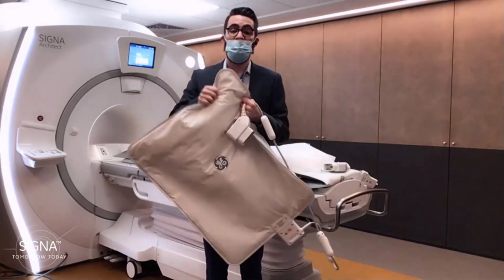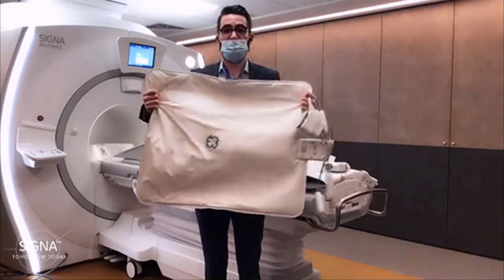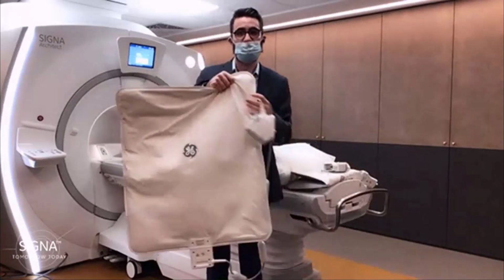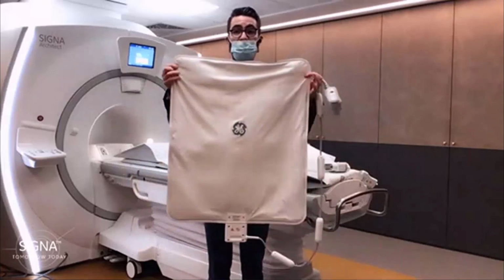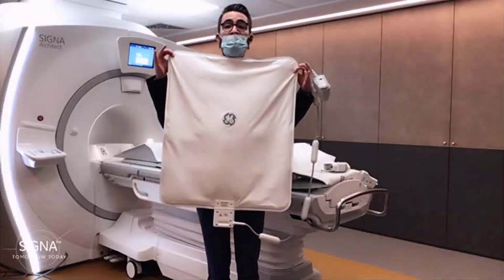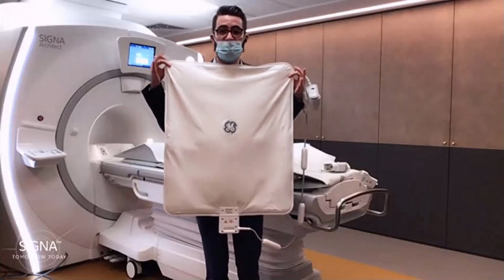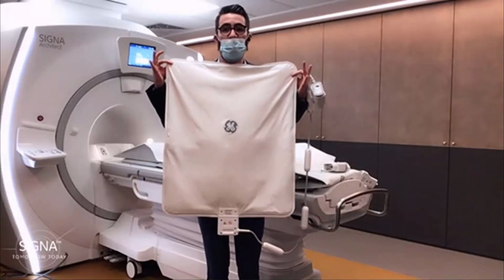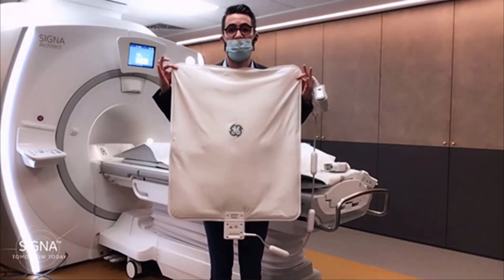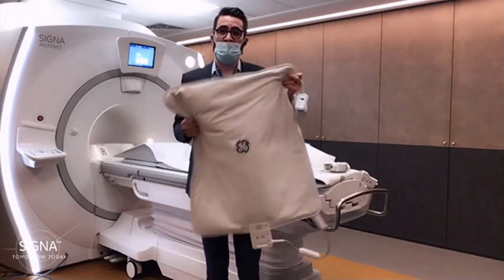Even if you have a pretty large patient, you can use it this way to cover the whole abdomen of the patient. Also, really important when we talk about body, the coil has a really large coverage. You can see I am 1 meter 90 centimeters, and you can scan thorax, abdomen, and pelvis on myself.